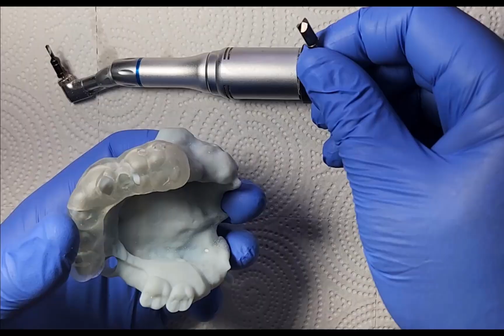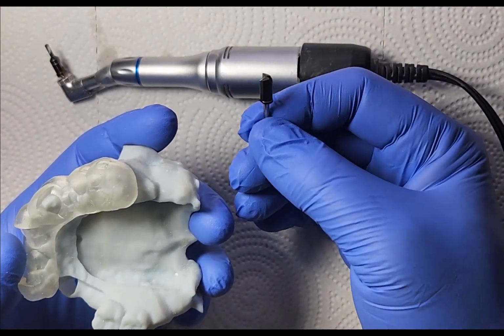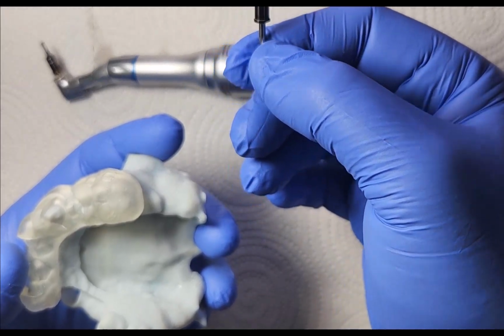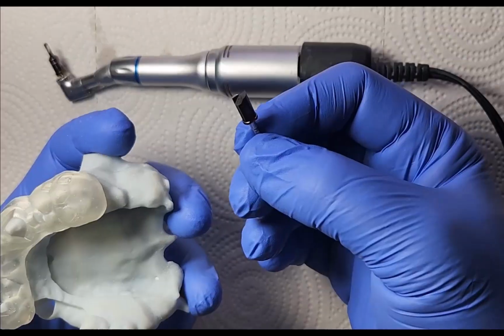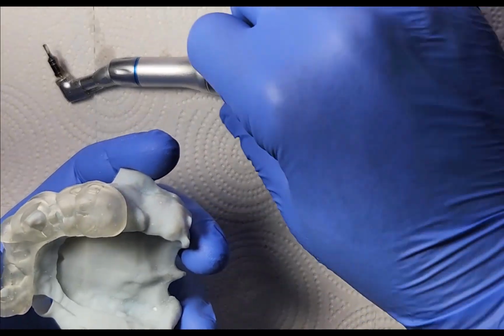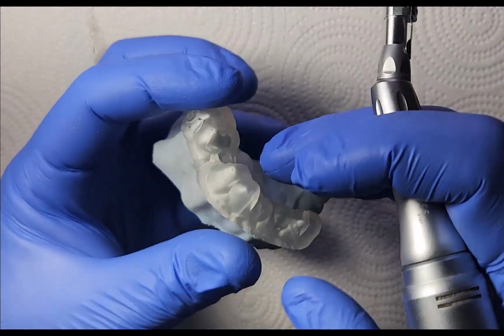Now, if you have an uneven ridge or you're placing a large diameter implant, oftentimes you might want to use the bone profiler first. This being relatively flat and not going in super deep, I don't think that's going to be necessary, and so I'm jumping straight to the 2x6 drill.